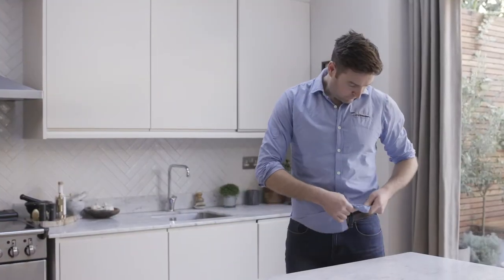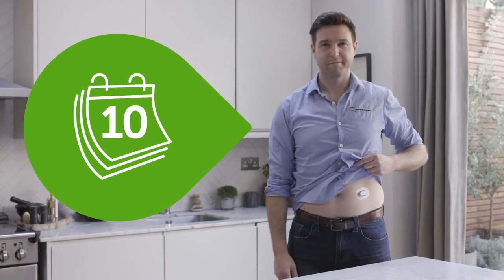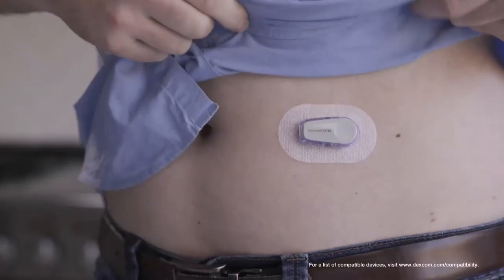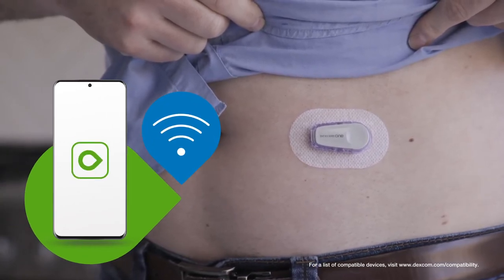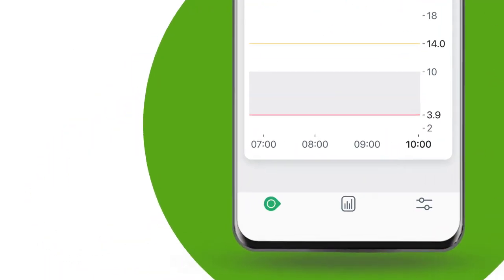It's just this little thing — a tiny sensor on your tummy or your arm. You can wear it for up to 10 days, shower with it, workout, live your everyday normal life. The sensor measures glucose levels just underneath the skin, whilst the transmitter sends data wirelessly to a compatible smartphone.